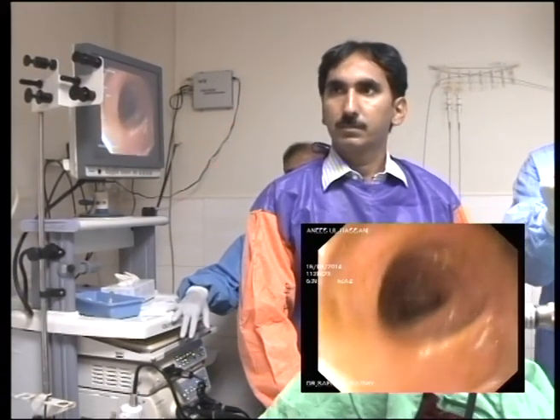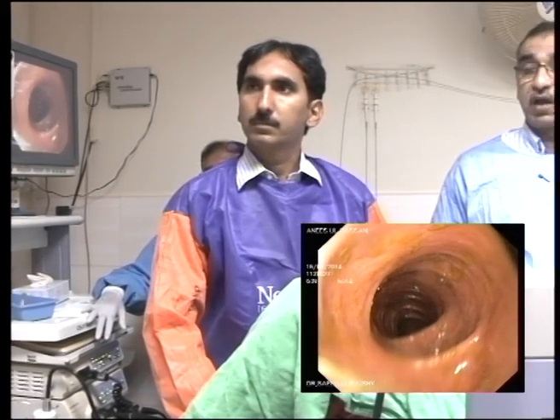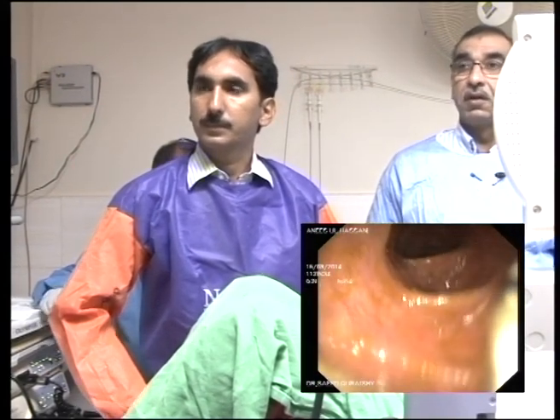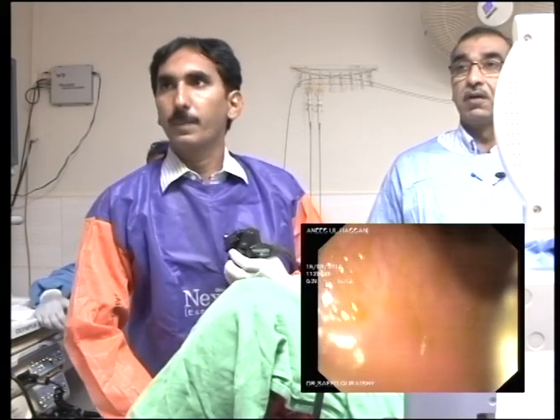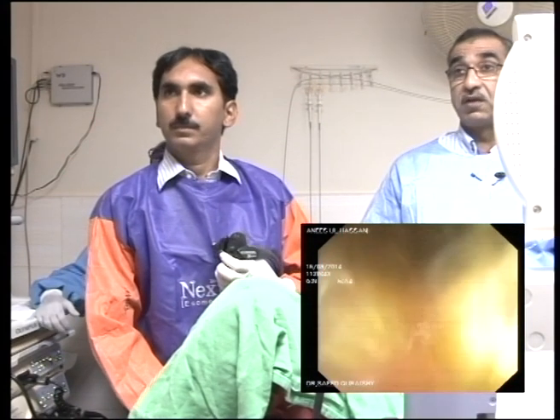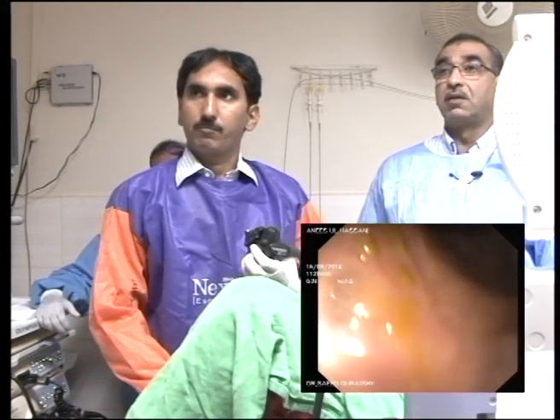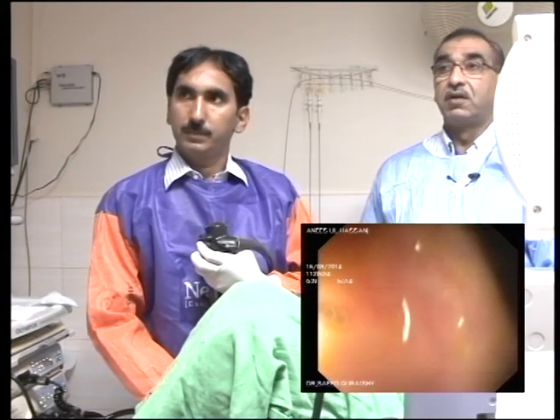Now again, point. Yeah, give a clockwise torque and try to withdraw the scope with clockwise torque. Clockwise torque and withdraw. Right? Okay. Then tight clockwise torque and withdraw. Point your scope tip up and clockwise torque at the same time. You should have the lumen in full view. Okay? Lumen in full view and withdraw.